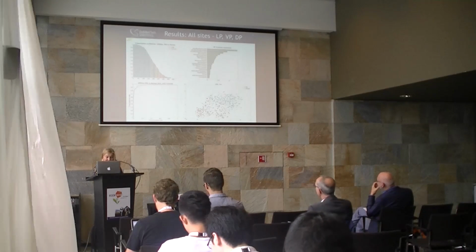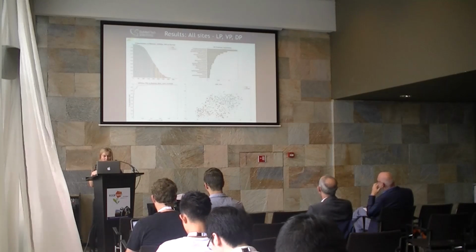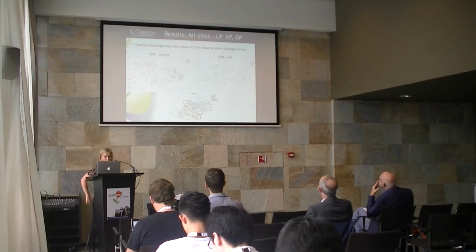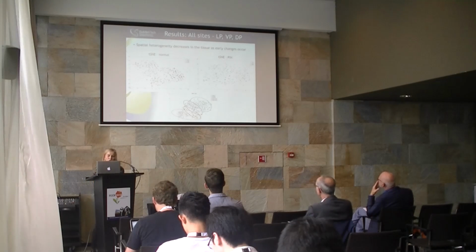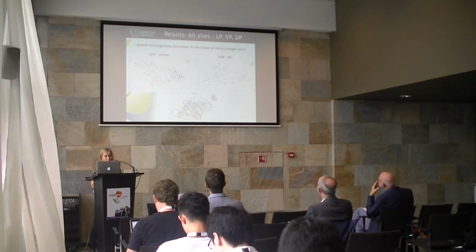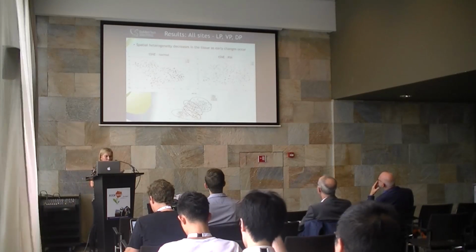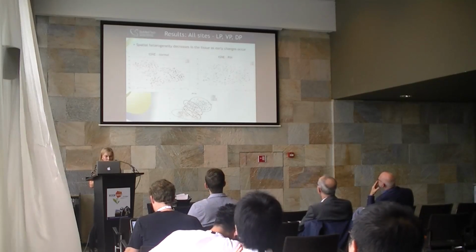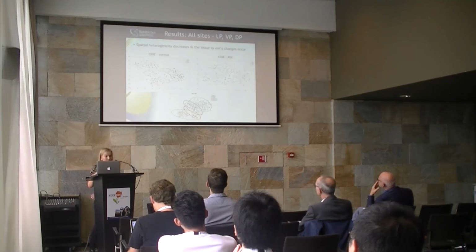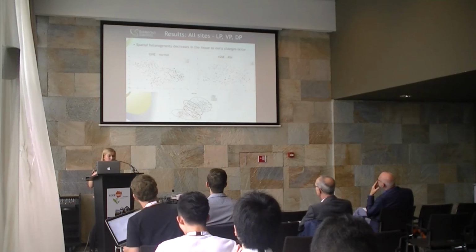Then there's also this t-SNE analysis of the feature data in a scatter plot, to visualize that you can actually separate these two groups. And when you look at this t-SNE analysis for only these normal samples and then only for these PIN lesion samples, you can see that in normal samples the different sides are actually separable, but however in this PIN lesion scatter plot, you can't separate these anymore. So spatial heterogeneity in the tissue samples decreases as these early neoplastic changes occur.